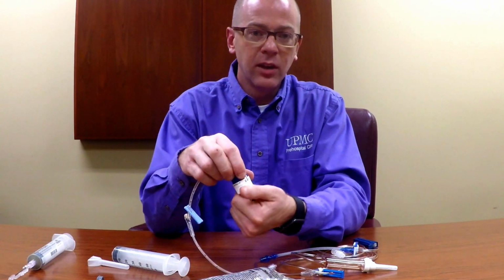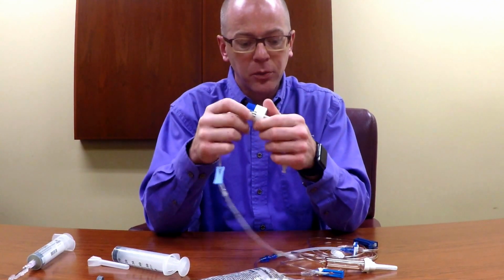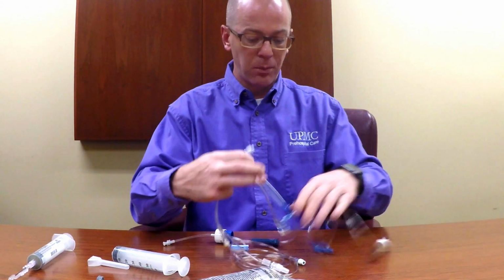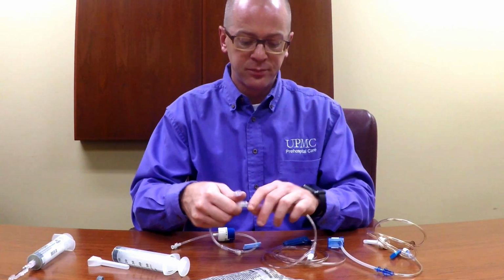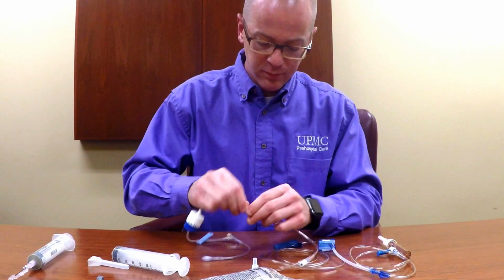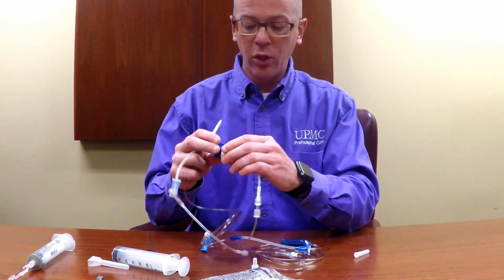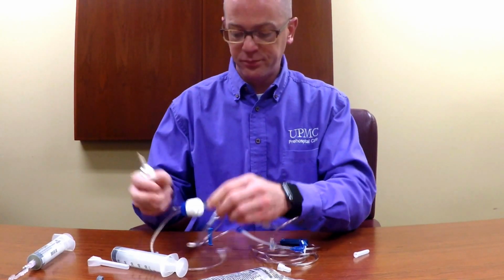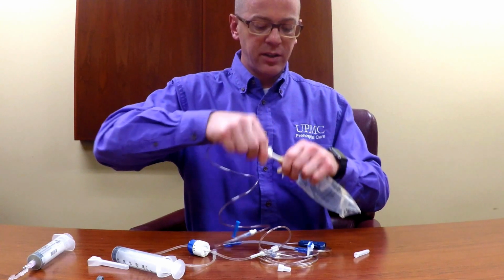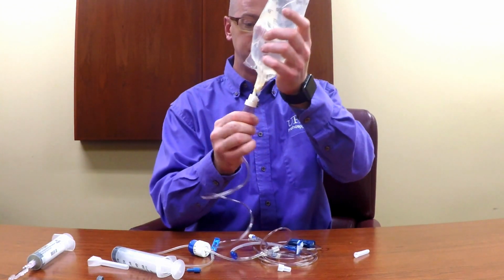So I'm going to connect this over, and I have my number scale on one side. If I turn it all the way to the left, it's in the off position. If I turn it all the way to the right, it's open and marked as prime. I want to connect this to the end of my 60-drop administration set, and make sure that it's turned all the way over to prime. I'm going to connect my micro drip set to my D10 solution, and I'm going to prime the tubing as I normally would.